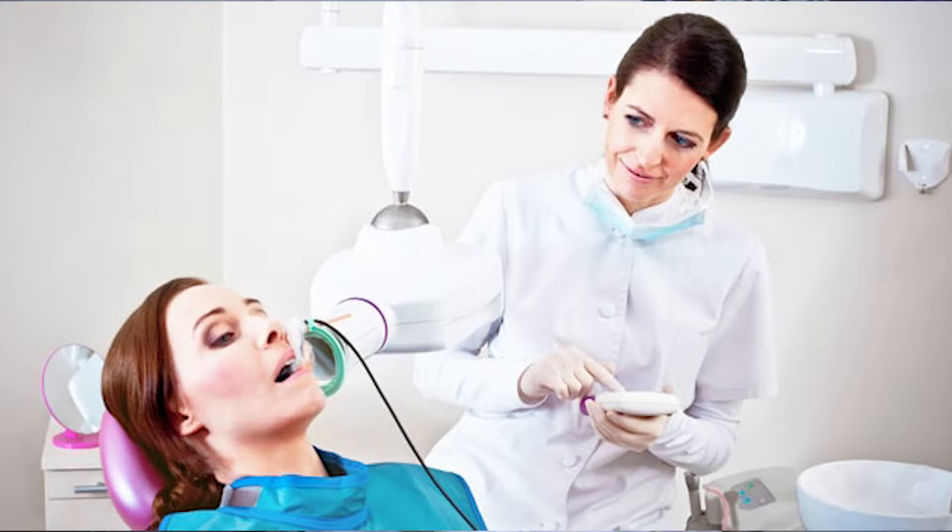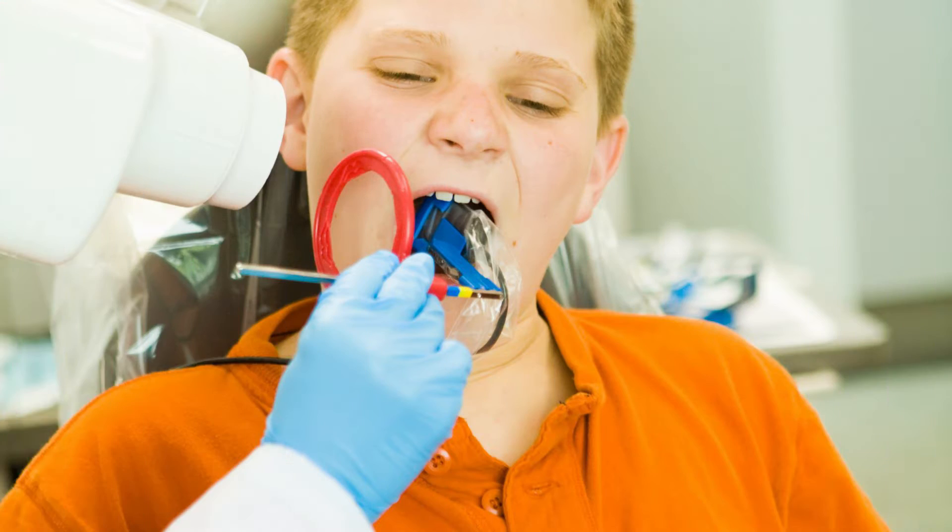The wire is the main failure point on traditional digital x-ray sensors. Looking at the wired sensors, they are the worst in the inevitable event that the sensor breaks due to bite pressure or damaged wire. They are prone to wear and tear. Also, that USB plug will eventually fail due to the constant plugging and unplugging. The lifespan of these old wired sensors typically lasts four to five years. Digital x-ray sensors are constantly in use between operatories and in and out of patients' mouths, providing many opportunities for them to break.